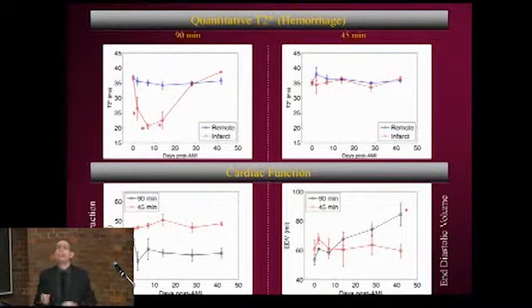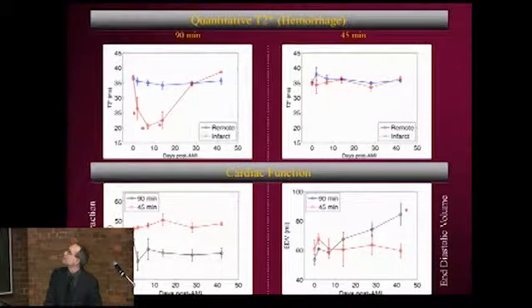So the heart does clean up that hemorrhage and iron deposition, so that by the time you get out to 4 weeks, it's usually pretty much gone in the infarct territory, and of course there's nothing going on in the remote territory. Whereas in the 45-minute infarct, you really just don't see any hemorrhage, so the T2 stars are pretty much constant.